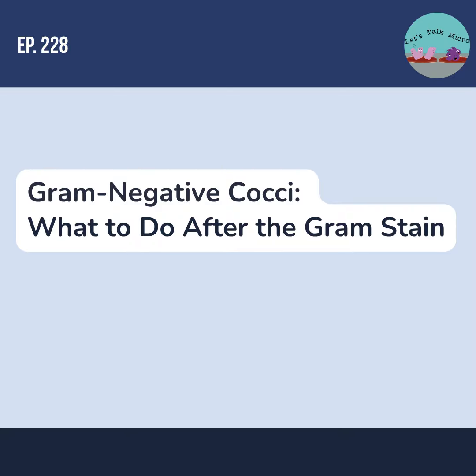Those of you that work in the lab, do you know that sometimes reporting a gram negative cocci can be a little scary or even daunting, right? Maybe you're that tech that finds themselves alone in the lab and you have a blood culture or a cerebrospinal fluid and you think it's a gram negative cocci, but you're not sure. And maybe you're afraid that you might be missing something like an Acinetobacter that has those plump coccobacilli and you want to make sure that you don't report the wrong thing, right? That affects your patient. So it can be a little scary sometimes.